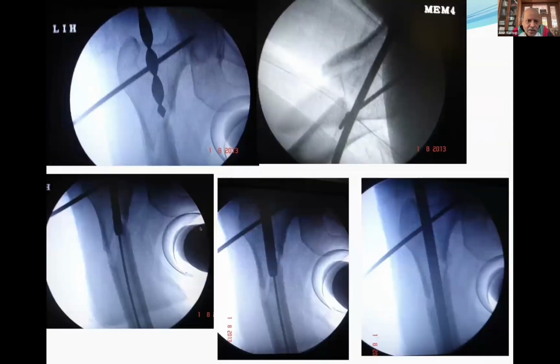See how medial that entry is. Do not put it where the fracture is. So put it in the medial. If you go right down, actually this is the medial cortex. So you still got some amount of varus. And that nail is coming. Once you put the nail in properly, you see that the varus reduces.